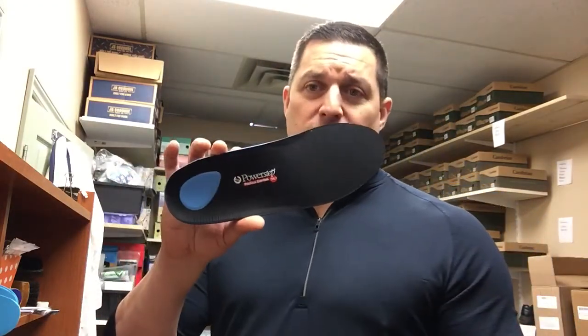So if you're looking for an insole that you can find on Amazon or wherever else, look for one that talks about having a fairly semi-rigid support, and you're looking for things that are going to give you max control. This one here, again, not to endorse any particular one, but this is called a Power Step, and it's a Power Step Protect Control, and that's the one that has that post on it. But again, we carry them here. That's the one that I kind of like the best for people that don't need a custom foot orthotic but do need some support. We tend to use that one.